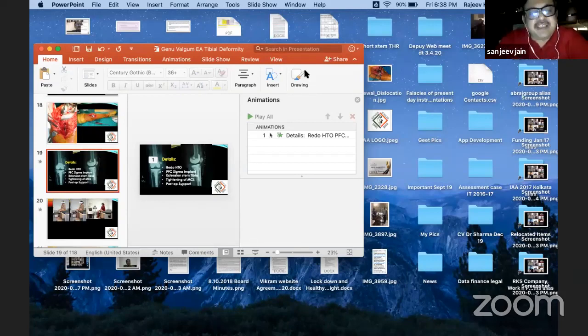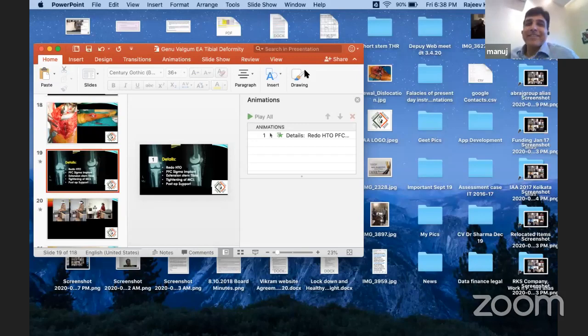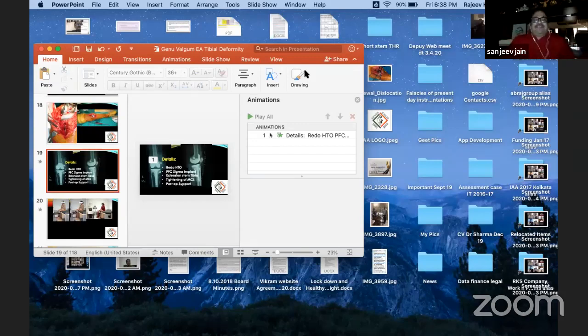Bharat, I have one thing to say here: there's hardly any difference between the 3 and 5 degree. The 2 degree is very difficult to measure. If this is a 3 degree and a 7 degree, then I can understand. But CAS guys will tell you a lot of difference, Sanjeev. Yeah. So just talking about 3 and 5 degree for 1 degree, I think is just not justifying.